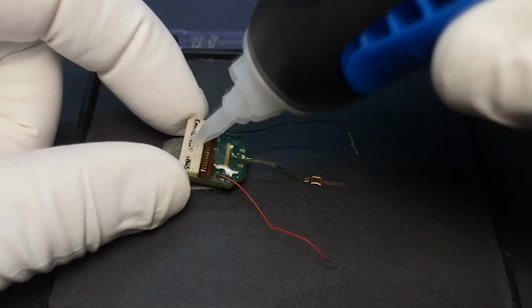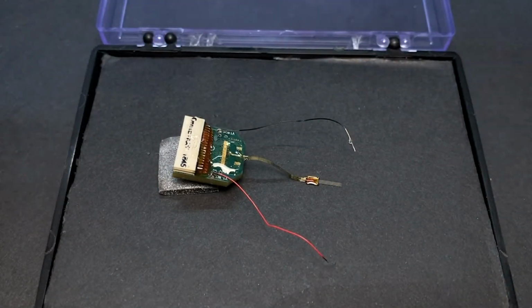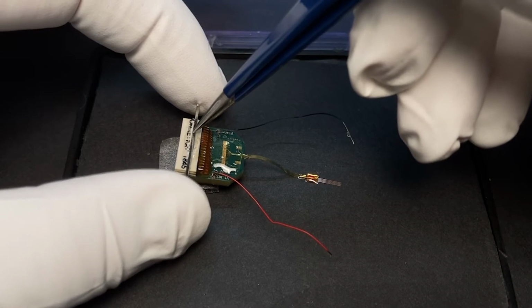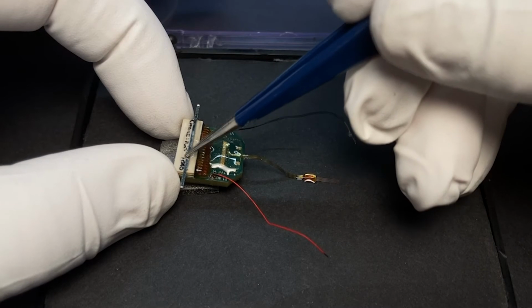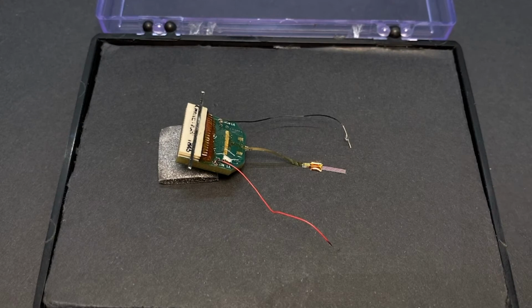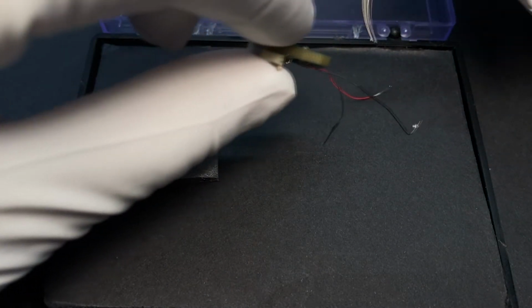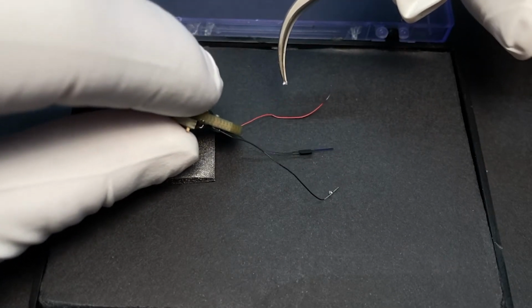super glue. And there are others who instead of placing the metal bar here, place the metal bar on the epoxy layer and then epoxy. There is no consensus about that. One important thing is that this should be a strong connection, because when you plug in the Omnetics connector, you create quite an amount of force, and this connection should withstand it. So once you glued it, then you flip your electrode and lay it down again. I think this is one of the scariest parts of this whole procedure.